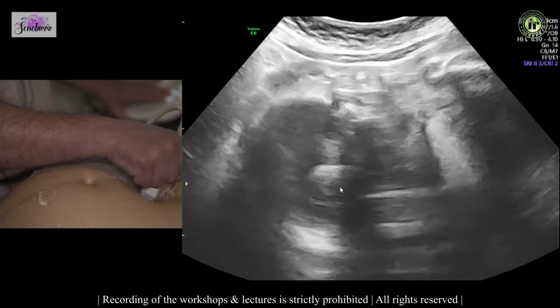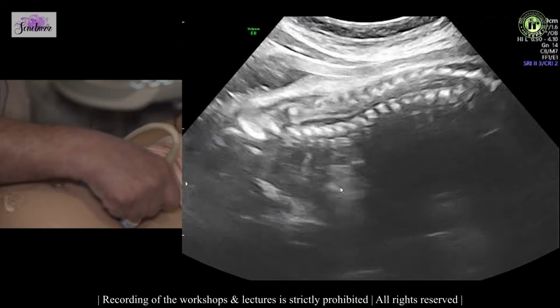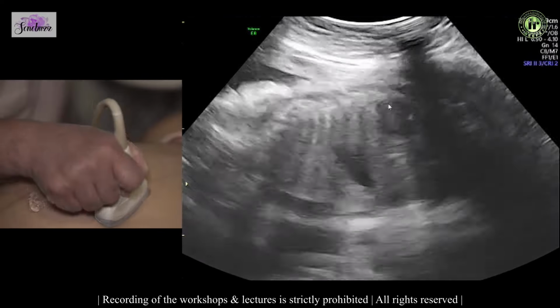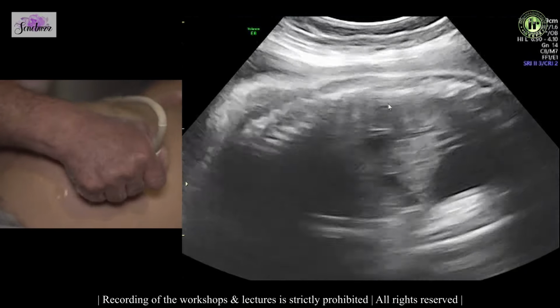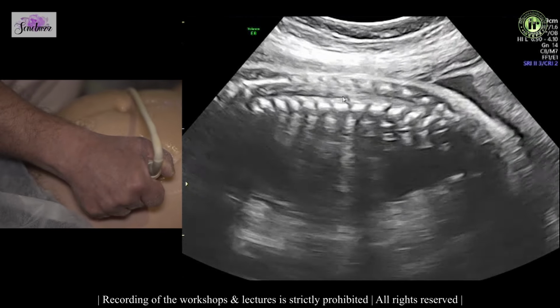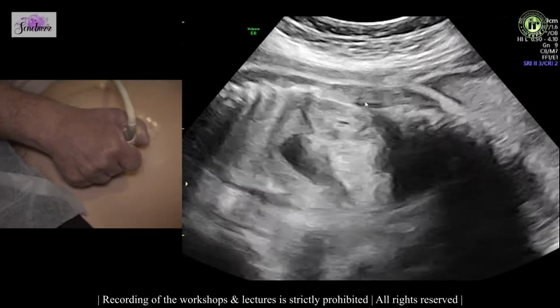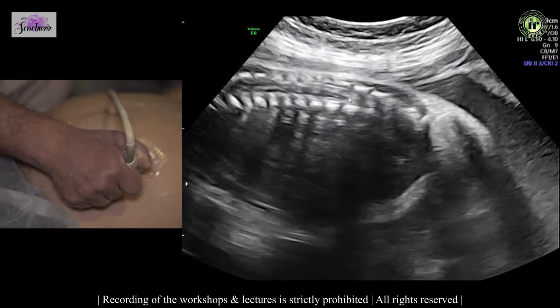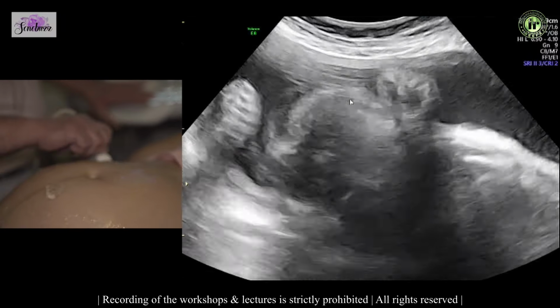As we go posteriorly, that's the thalamus and the choroid plexus in the lateral ventricles. We also look at the spine. That's the cord here. This cord usually ends at L2, L3. That's the termination of the cord. That's the L2 level vertebra. L5 is identified by the pelvic bone, and then you count upwards, and that's L2, L3.